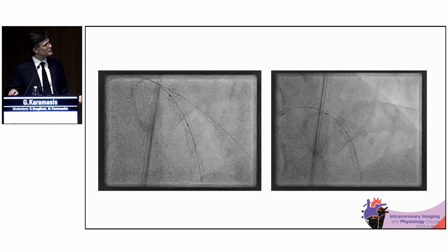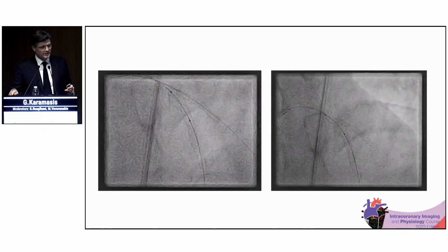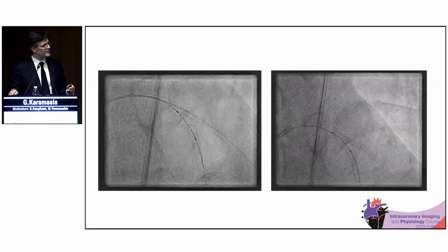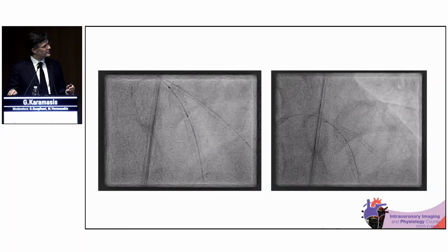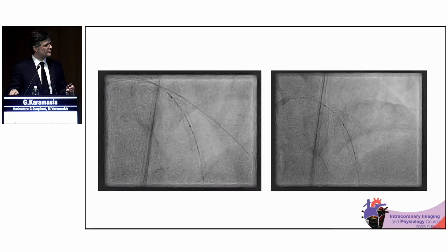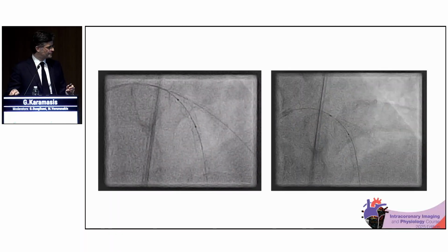To help the discussion, I will show you also these two images, and this is a stent boost, and what you can see is that the stent in the diagonal is protruding within the LAD. I think it's very obvious in both pictures. I will stop here and maybe we can discuss how we can proceed starting from here.